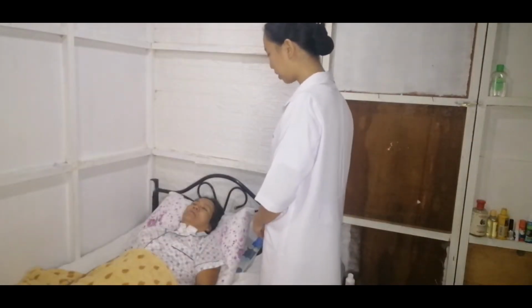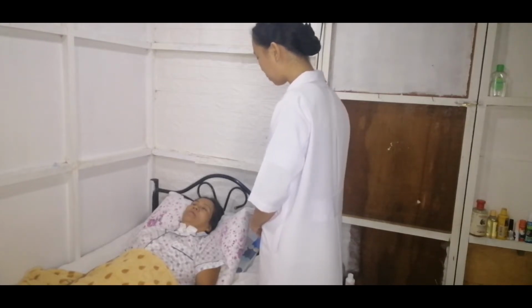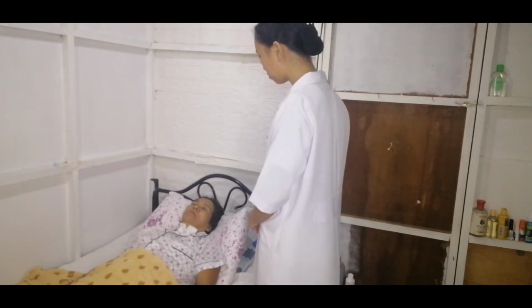Hello po ma'am, good morning po. So ngayon po ay magpo-provide po ako ng tracheostomy care. So, ginagawa po natin ito para po mapanatili natin malinis at maiwasan po ang infection.